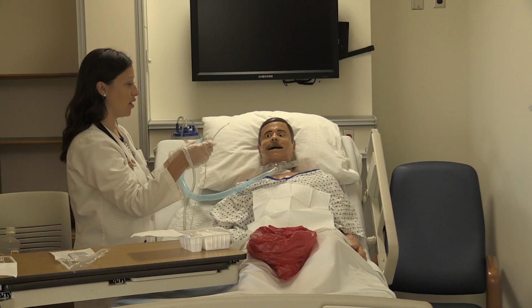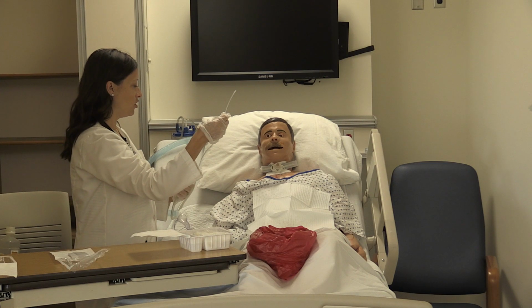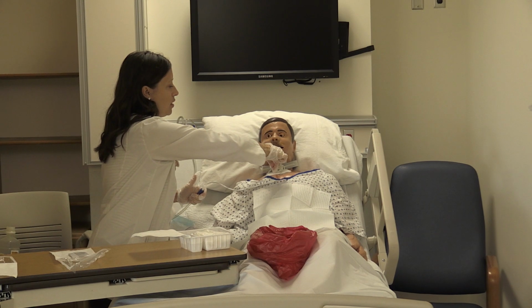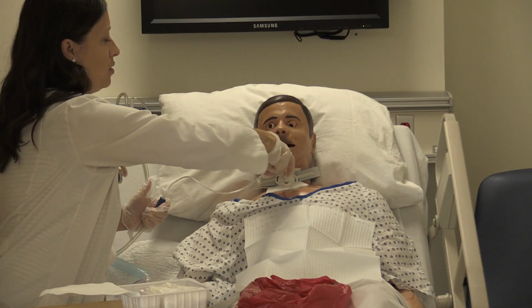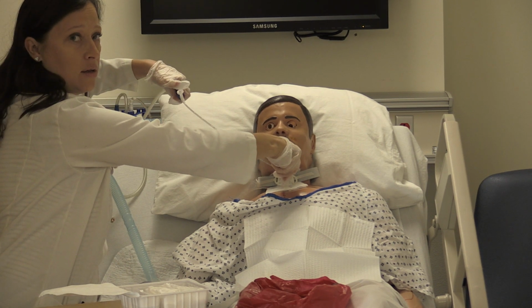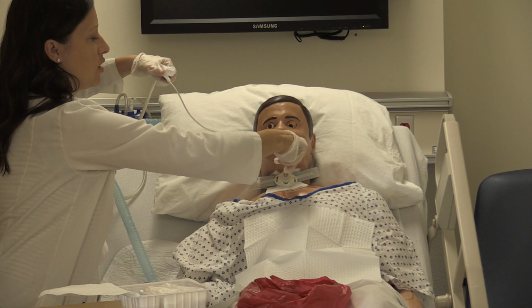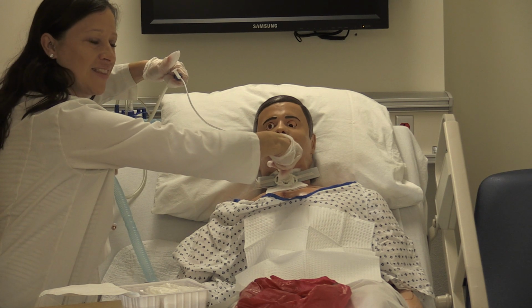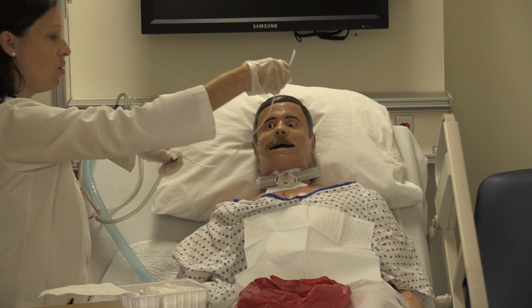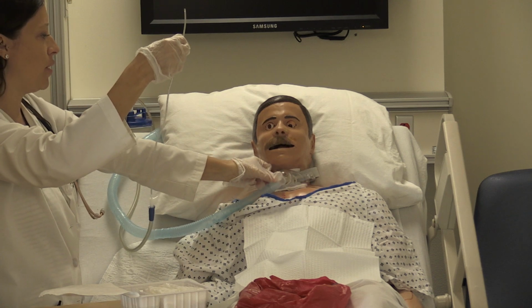Two minutes have passed. We're going to go ahead and do another suction pass. All right, Mr. Smith, here we go again. We're going to go another time, get all those secretions out of your lungs for you. So you're going to go ahead and insert down until you meet resistance. When you meet resistance, then you're going to want to twist, intermittent suction. It's kind of like patting your head and rubbing your belly at the same time. Okay? That's out. We got a lot of secretions out that time, Mr. Smith, so I bet you're going to be feeling and breathing a lot better now.